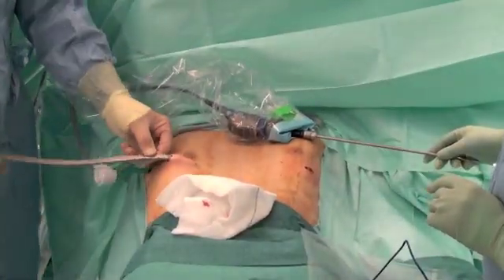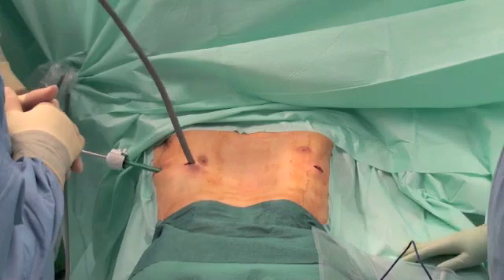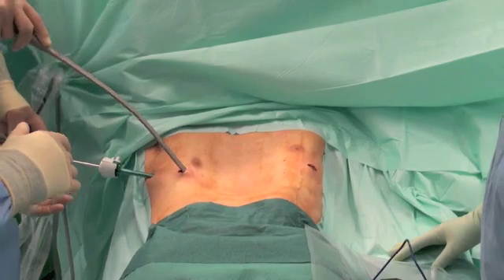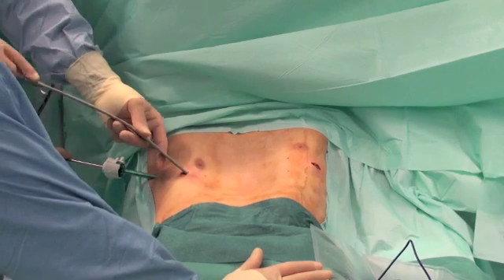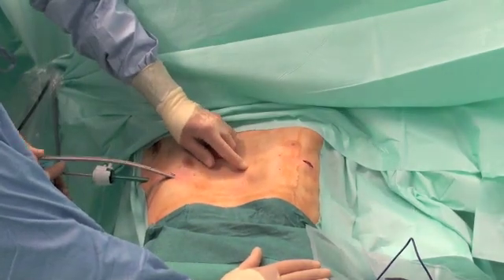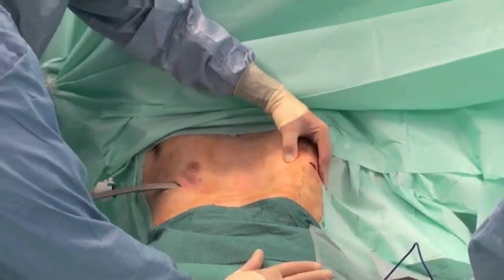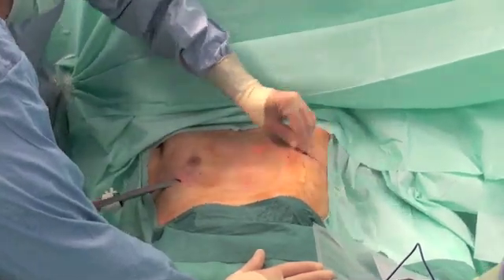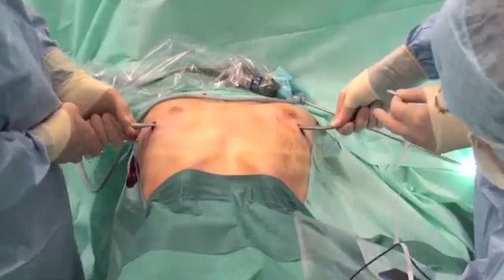This is the insertion device. It is placed through the intercostal muscle — he has already pushed it through. Then under vision from the inside, following the back of the sternum, he is pushing it gently round the sternum under guidance. There is a television on the other side just out of shot. He is feeling for the other end of the introducer, and when he feels it is in the correct intercostal space, he just pushes up very firmly. It is very important to lift up here so that you don't strip the intercostal muscle off on the other side.